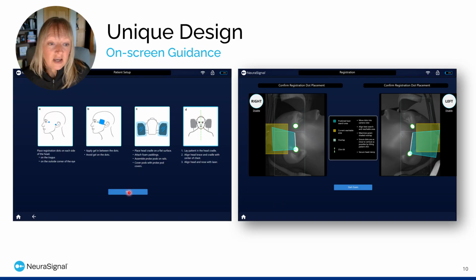Once we select next on this screen, we will see the screen on our right here. It will have live cameras that will register all 4 of these stickers or fiducials, and it will plot out the square or area that the robot will scan.